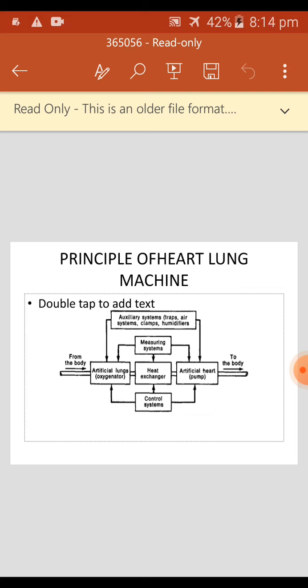Next, the principle of the heart-lung machine. Centrifugal pumps use forces to transport blood instead of tubing compression. Because of the technical principle of operation, the centrifugal pump has a limited application. Centrifugal pumps have the advantage of delivering limited amounts of air, causing less blood damage in the long run. An additional flow meter is required to determine the delivered flow, which is a disadvantage.